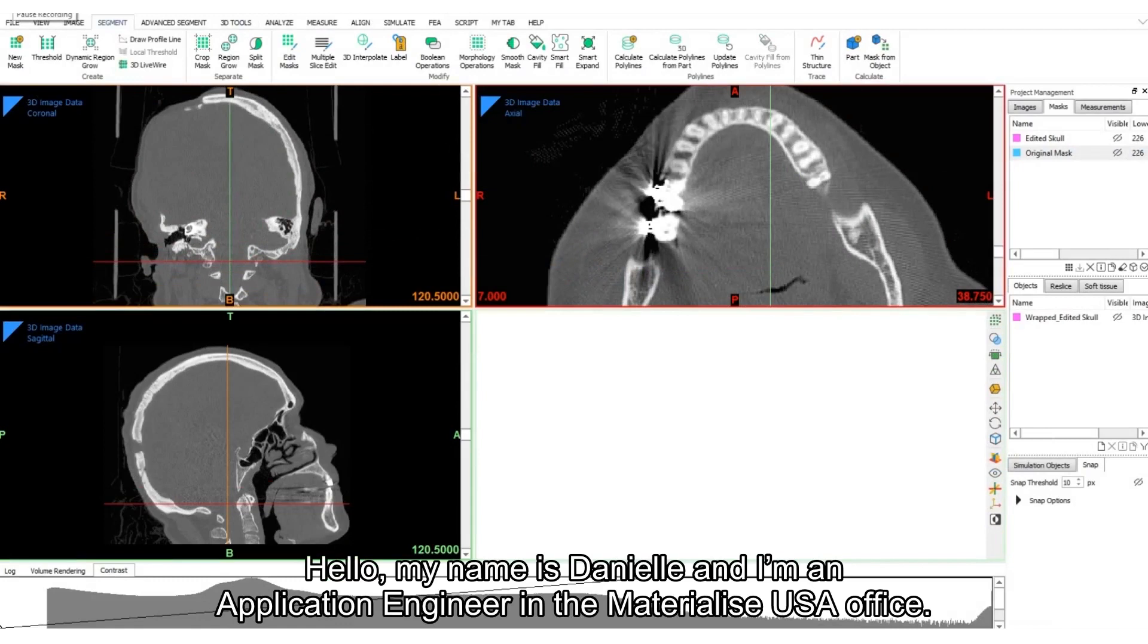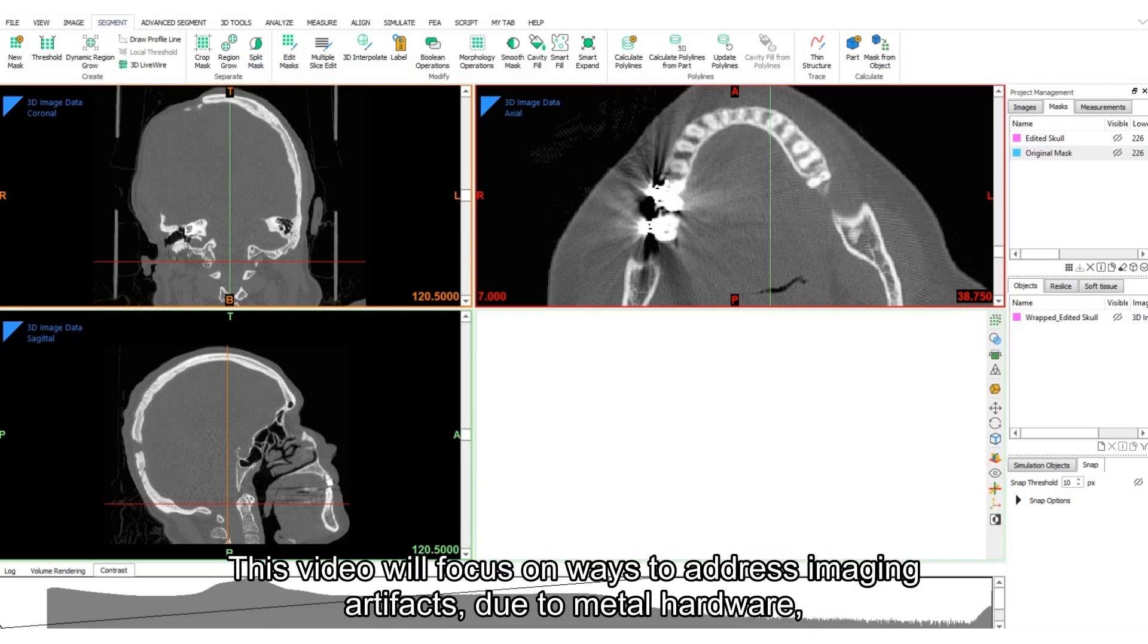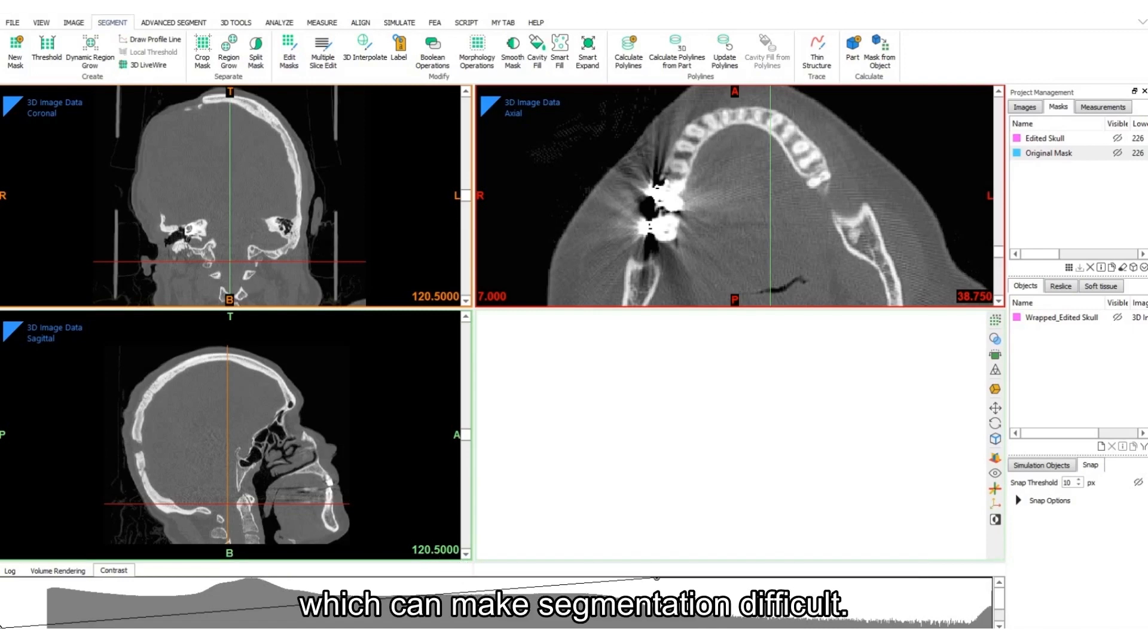Hello, my name is Danielle, and I'm an application engineer in the Materialize USA office. This video will focus on ways to address imaging artifacts due to metal hardware, which can make segmentation difficult.